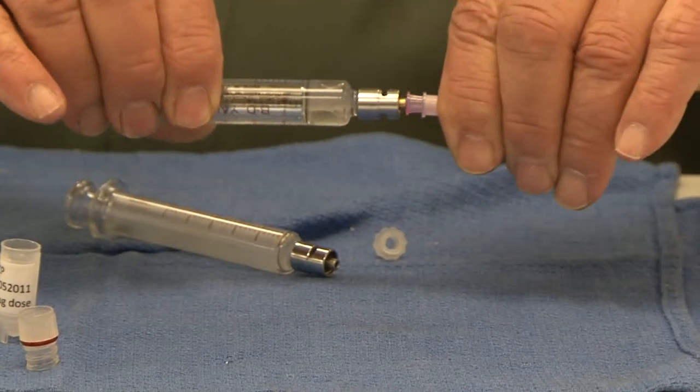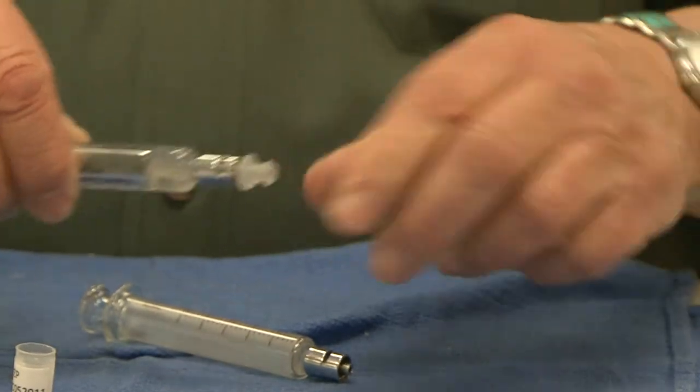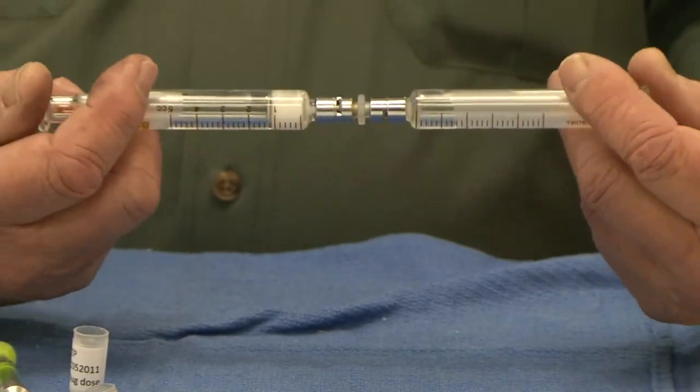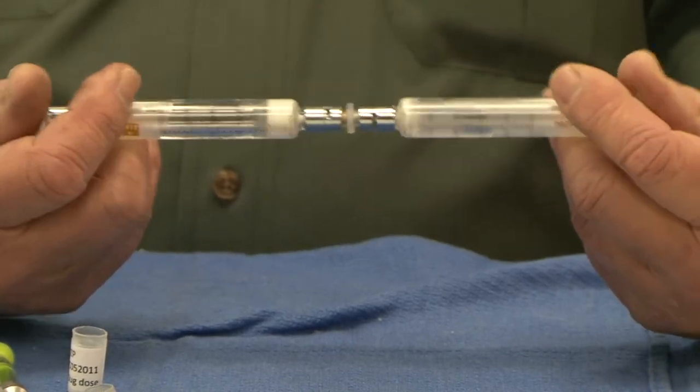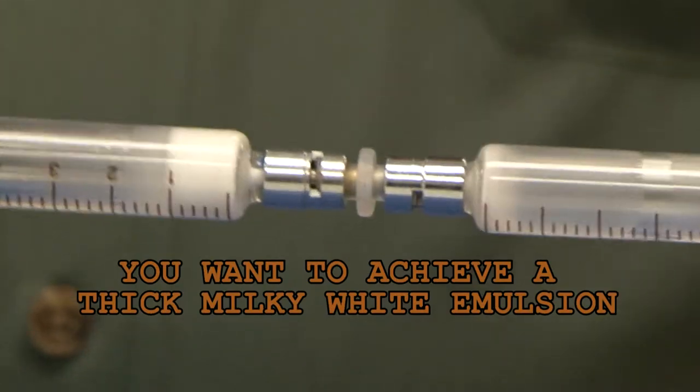Now carefully remove the needle and connect the two syringes by means of the plastic lure lock connector. After making sure they are firmly attached, give the two syringes 100 strokes, pushing the emulsion back and forth into the two syringes. You want to achieve a nice thick milky white emulsion. This is very important.